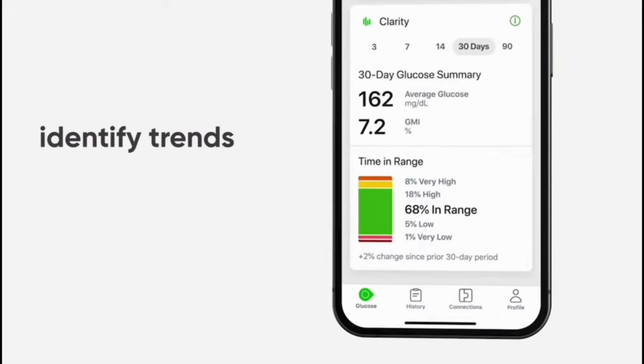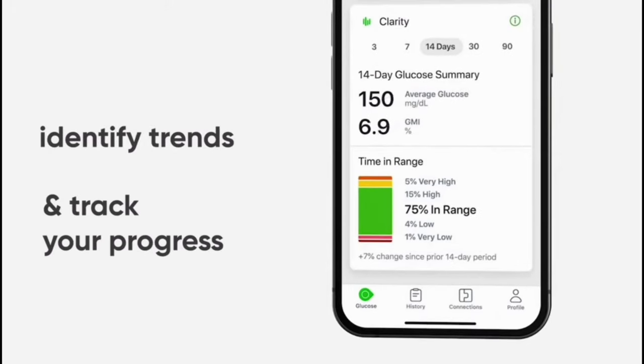With the G6, the data available in the app was pretty limited. Anytime you wanted to access anything beyond 24 hours of data, you had to load up Clarity, which was a second application. Well, the good news is with the G7, Clarity is built right into the app — it's right below your regular glucose readings. All you do is scroll down just a little bit and you have all of your Clarity data right there. You can see the last 3, 7, 14, 30, and 90 days of data all right from the main screen.